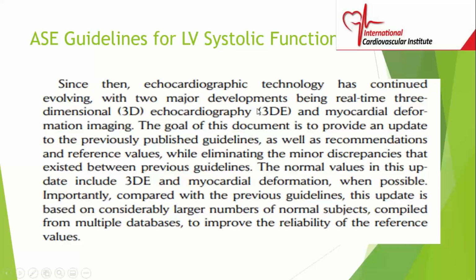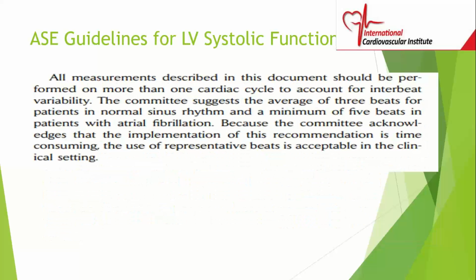A lot of institutions are doing strain evaluation. So these are some new developments in echo. The goal of the guidelines is to provide an update to the previously published guidelines, and they're going to give you some normal values for the changes that were made.